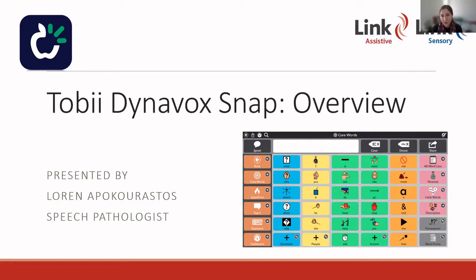I'm a speech pathologist with several years of experience supporting clients with AAC and assistive technology solutions. So this webinar will provide just a brief overview of Tobii Dynavox Snap, including some general information on how to use the program, understanding the key features and settings, understanding the different page sets that are available, and some other cool things like how to print off page sets. There'll be time for some questions at the end, so feel free to type any questions you might have into the Q&A for discussion.